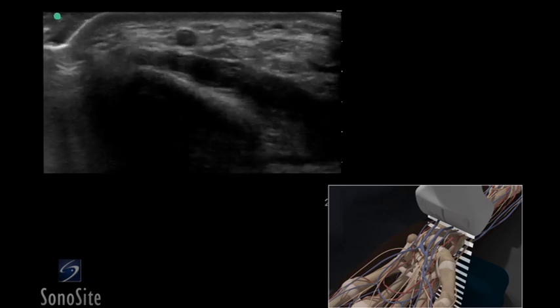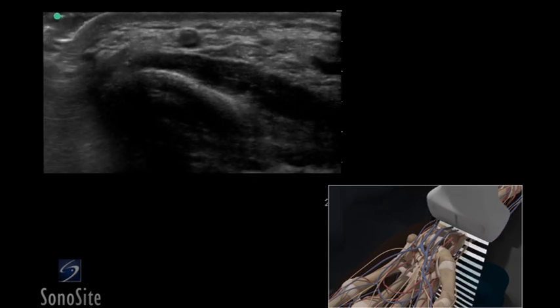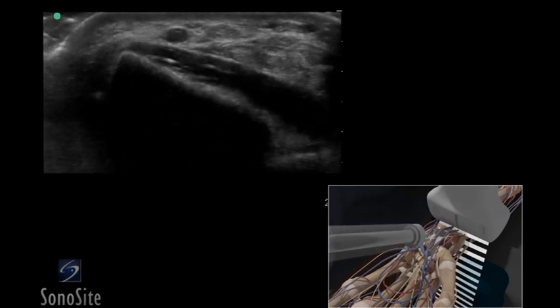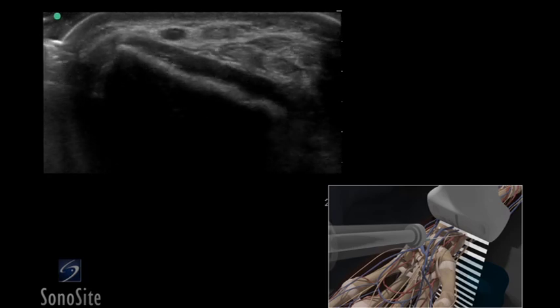Adjust the transducer so it is centered over the artery. Follow the needle entry by slowly sliding the transducer in the direction of needle advancement. The needle will appear as a small bright dot.